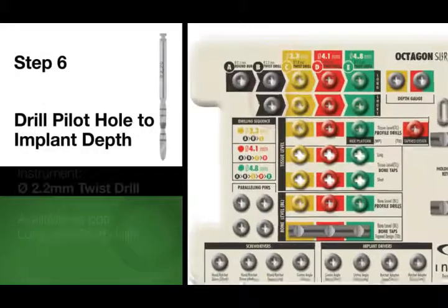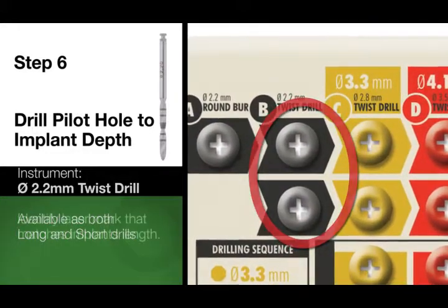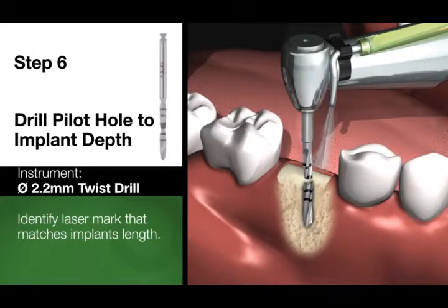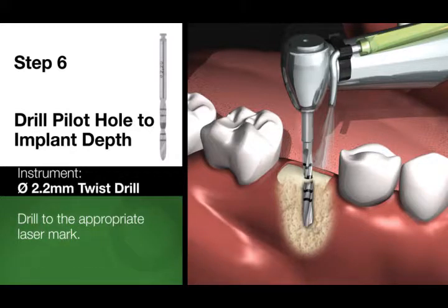Step 6. Using the 2.2 mm twist drill, identify the laser marking matching the length of the implant you will place. With a motor speed between 800 to 1200 RPM and copious irrigation, drill to the appropriate depth.